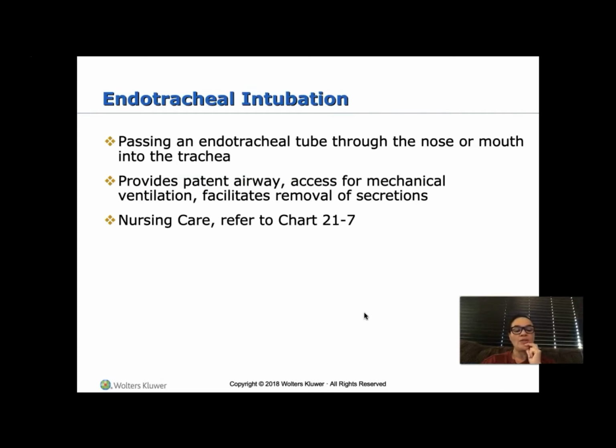This is what the patient is going to feel like, breathing through a tiny, tiny, tiny straw. It is one of the scariest feelings in the world. Right away, our fight or flight kicks in, our panic, and we are going to want to fight that tube, tooth and nail, and try to pull it out. So sedation goes hand in hand with an ET tube for the safety of the patient, okay?